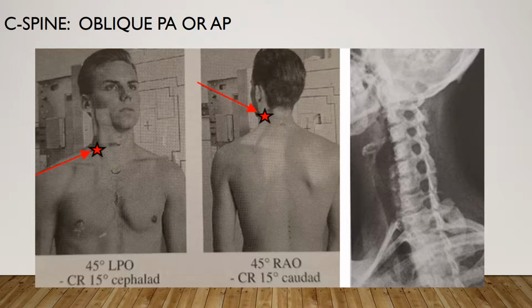You want to have an optimal density and contrast with no motion. And you want to have soft tissue and bony margins and trabecular markings sharp.